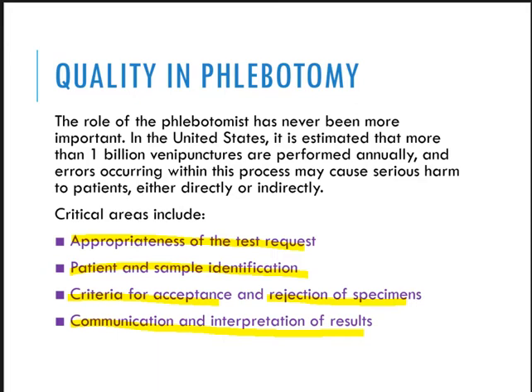It is very important, guys, because take this situation for example. Say we have patient A who will be diagnosed with cancer, and then we have patient B who is healthy. And then what if the laboratory results came back, and when we draw blood from the two samples, instead of patient A having the diagnosis of cancer, it went to patient B because there were mislabelings that had happened between the two samples.